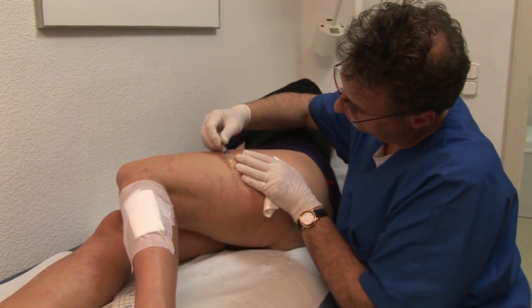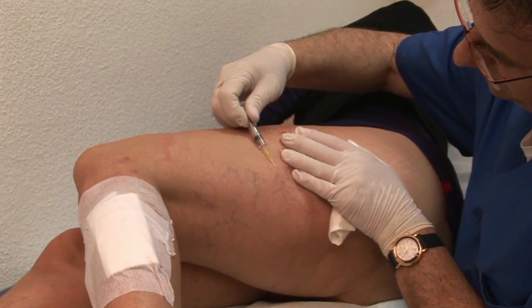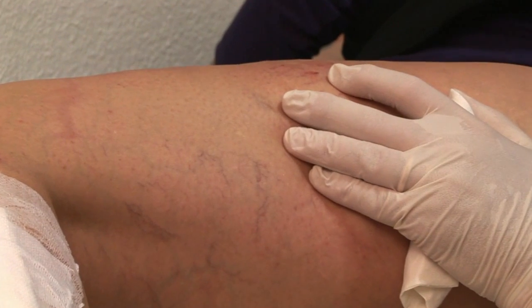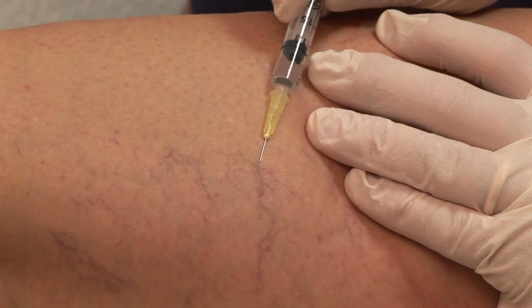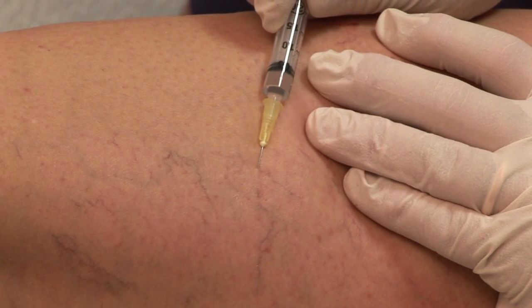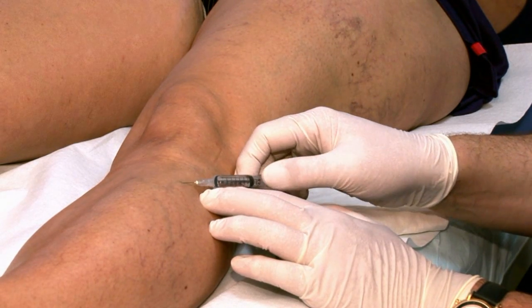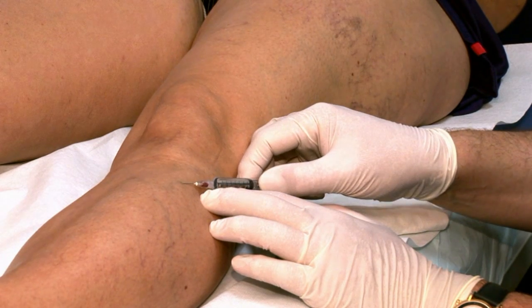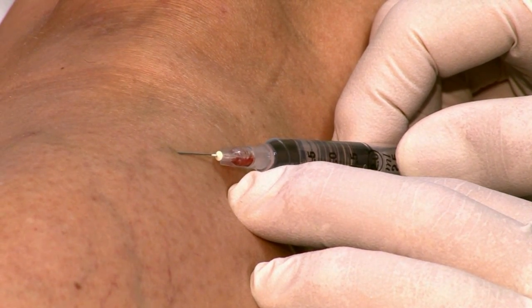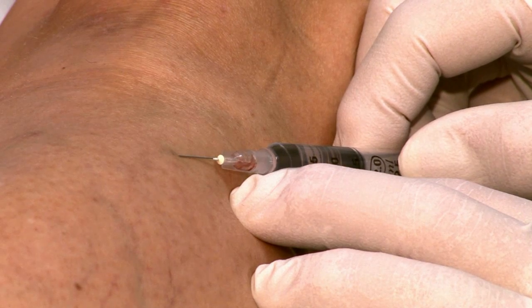Smooth-moving syringes should be used for injection, as this makes the intravascular injection easier to control. As a rule, 2 and 5 milliliter disposable syringes are used. The puncture should preferably be carried out tangentially to the skin. For the injection, the doctor stretches one hand over the varicose veins, so that the other hand can be used for the injection. The aspirated blood flowing back into the syringe shows that the cannula is in the correct intravenous position. Aspiration is not usually possible for telangiectasias, but it is recommended for reticular varicose veins.